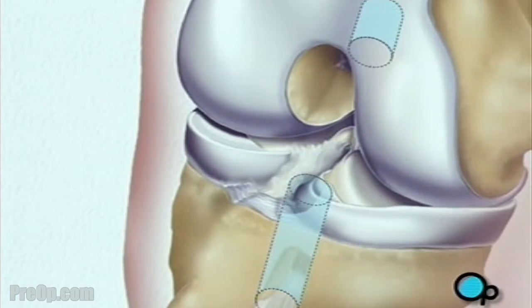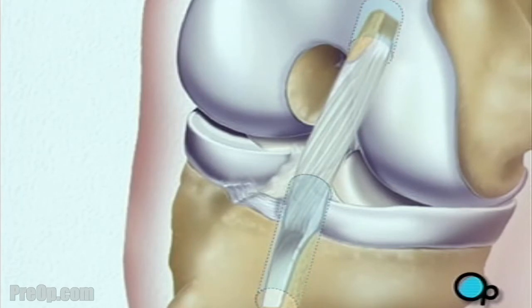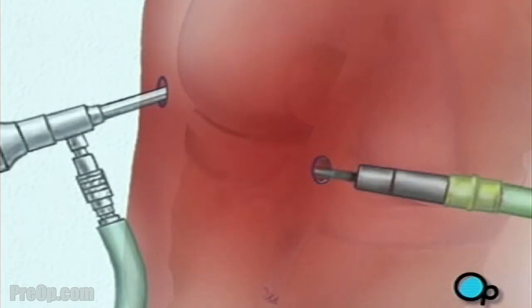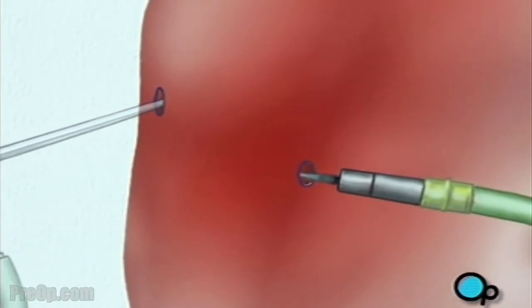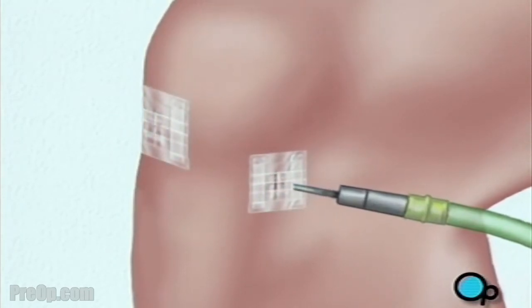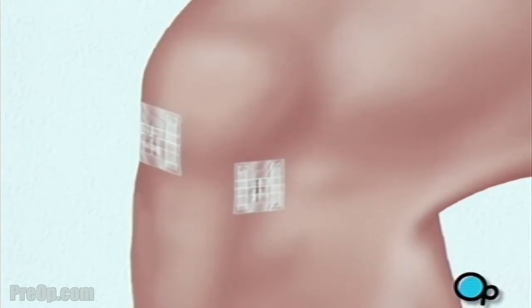The ligament graft is then inserted into place. When the procedure is complete, the team withdraws the instruments and the surgical fluid drains safely from the knee. Following surgery, sterile dressings are applied. To aid in healing, your knee may be stabilized with a brace and you'll be encouraged to use crutches during the recovery process.